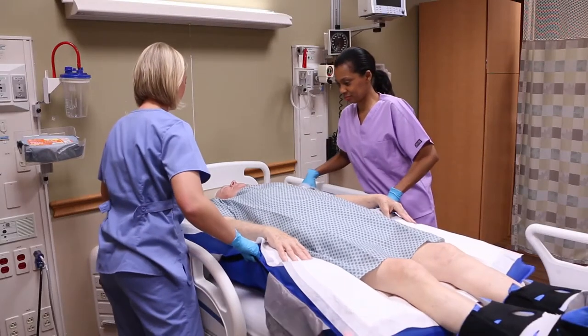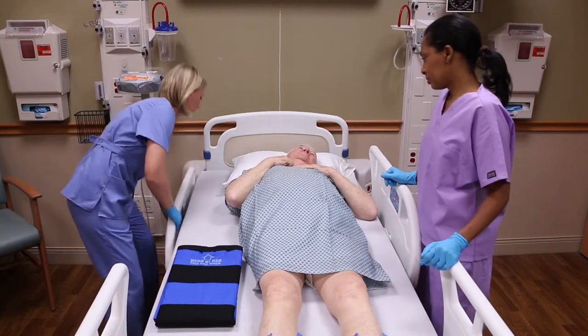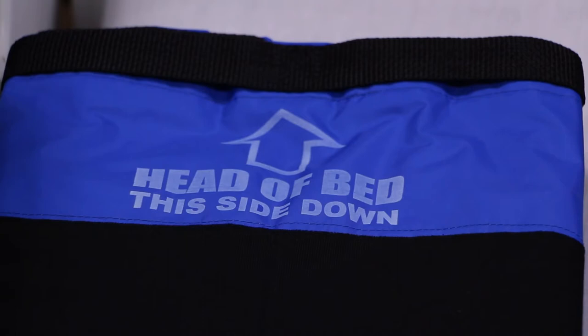The AirTap system should always be performed with at least two caregivers. Lower the bed rail where the glide sheet is being placed. Place the folded glide sheet with microclimate body pad alongside the patient with the printed arrow pointing toward the head of the bed.